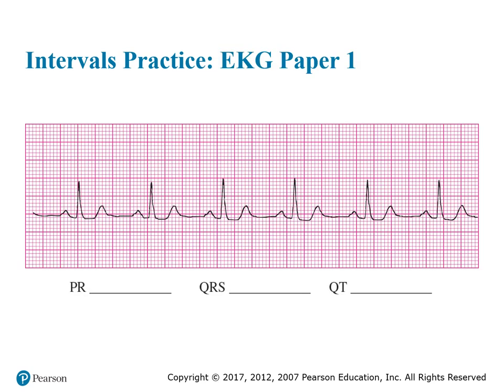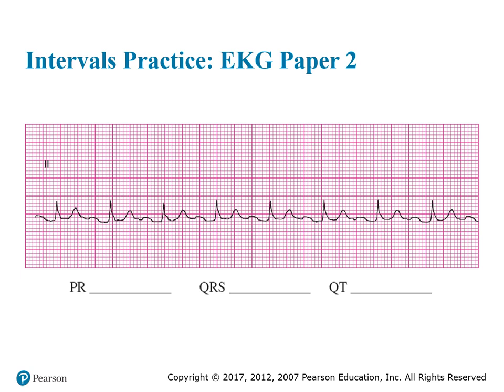So let's take a look at, not this one. This one's easy. Let's take a look at this one. So we have R here. We have T. And then we have P, R, T. Because guess what we don't have? A Q and an S. Because remember, Q is negatively down. S is negatively down. This is only positively affected up.